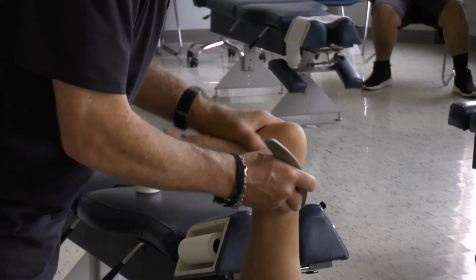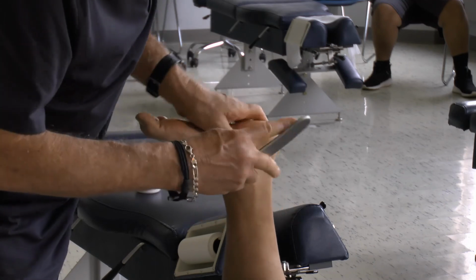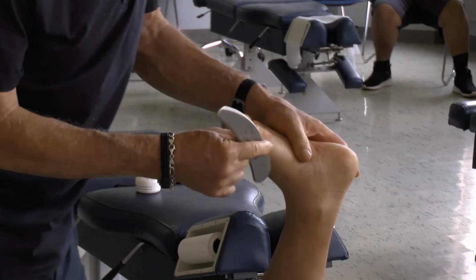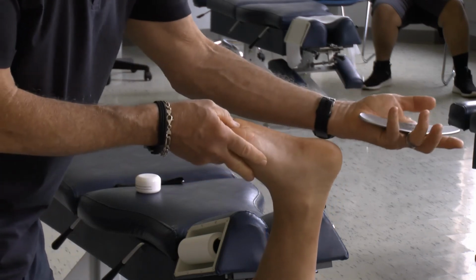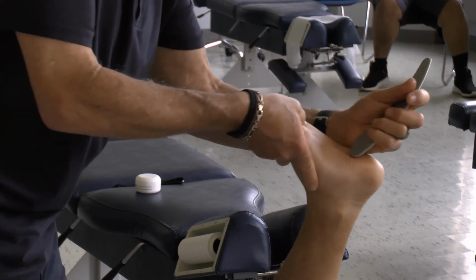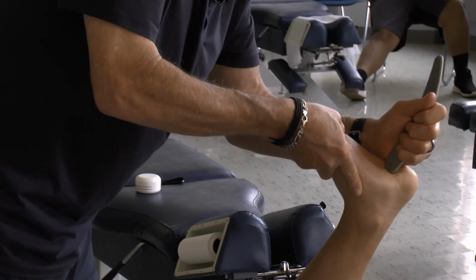We'll do this also with the knee straight to pick up more of the gastroc. And before I move down and treat the gastrocsoleus, usually this is like the finale, I'll take my dagger grip right here and just really get into that medial calcaneal attachment.